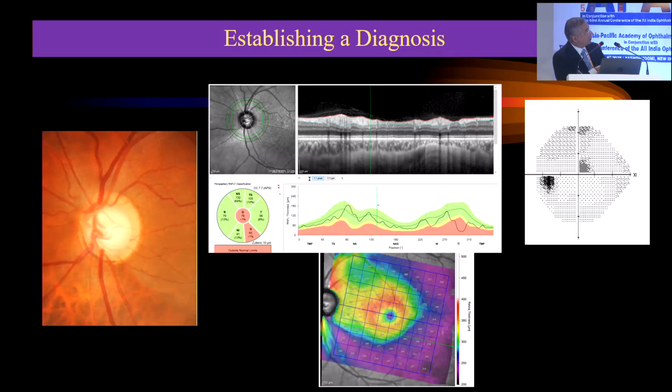But this has to correspond to a loss of the macular thickness as well. Whether you do total macular thickness, that is total retinal thickness, or you do GCC, whichever you do, it has to be corresponding, because it is the same structure.